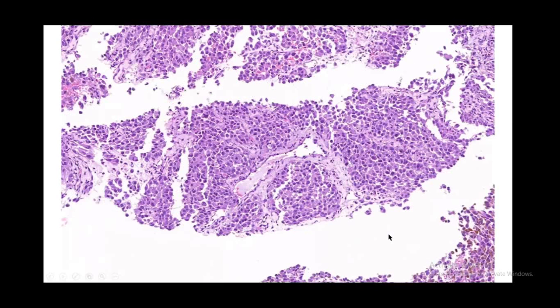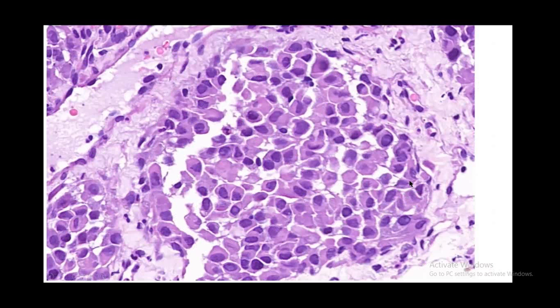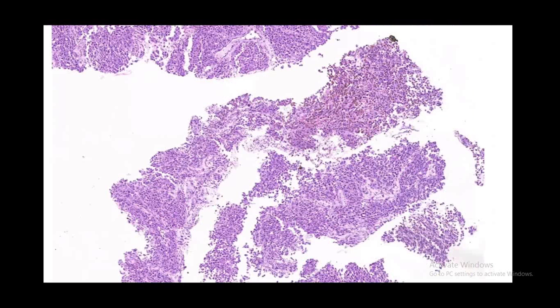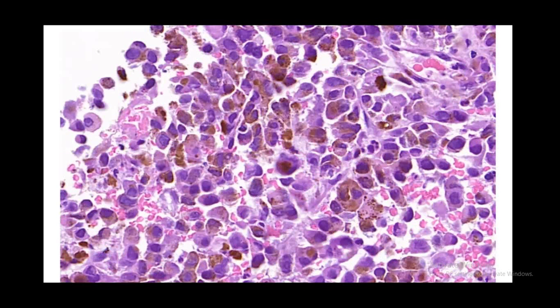This biopsy showed a very cellular tumor. The cells recapitulated the cytology features that we had seen on the FNAC. They were plasmacytoid with oncocytic cytoplasm, in diffuse sheets with eccentrically placed nuclei. Cells do show hyperchromatic, irregular nuclei. And in some of the cores, a brownish pigment was identified, and we found intracytoplasmic blackish-brown fine pigment in the cytoplasm of the tumor cells.